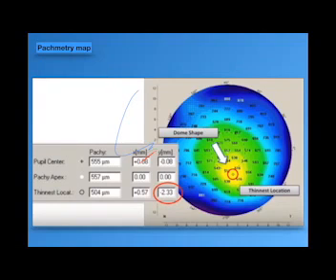While in correlation with the other one, they found that the difference in the curvature between both eyes, and the difference between the pachymetry maps in both eyes, are out of the normal and accepted range, so they could diagnose that this is a case of early keratoconus.